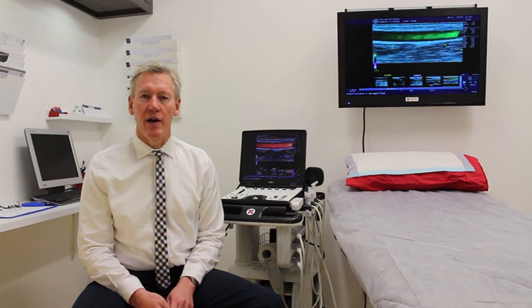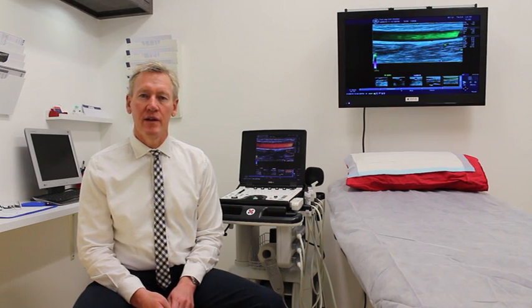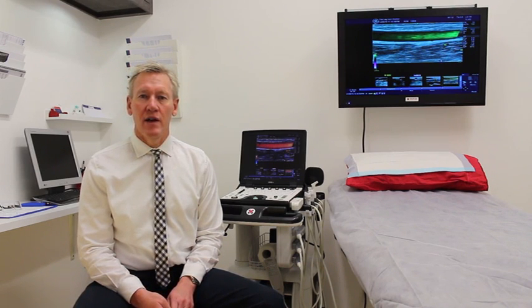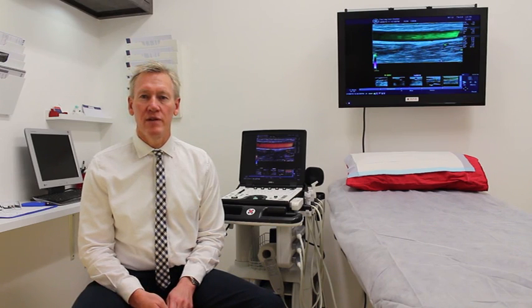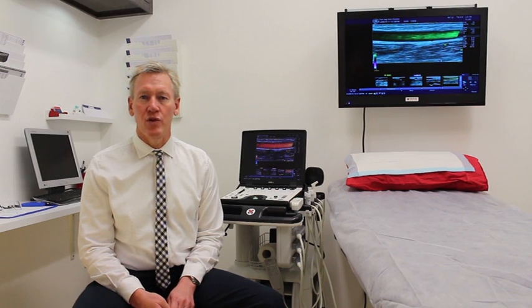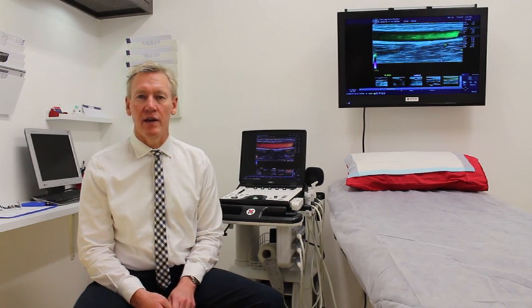As you may probably know by now, all veins contain small valves which point back to the heart. This prevents blood reversing back down towards the bottom of the foot. We want venous blood to get out of the leg so the new, fresh arterial blood can get into the leg. Ultrasound allows us to see veins deep under the skin and also to dynamically test them to see whether or not they're functioning properly. We can see whether the vein is pushing blood back to the heart and if it's doing it properly, and whether or not blood is leaking back in reverse down the leg.